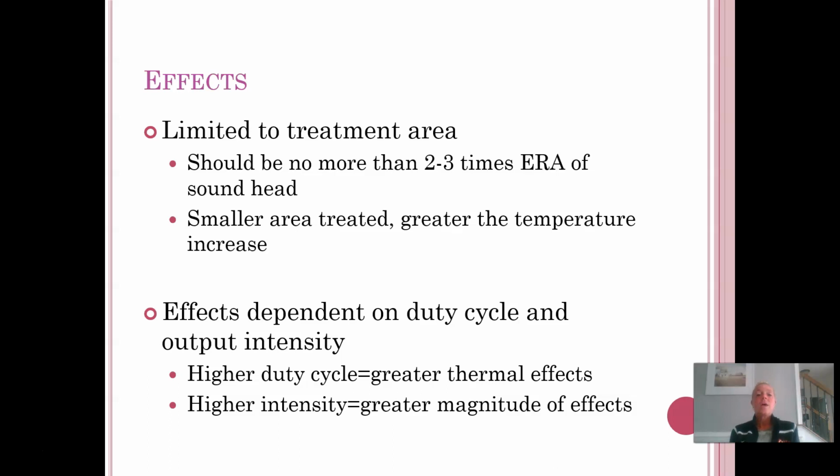Again, the effects are going to be dependent on the duty cycle and the intensity. The higher the duty cycle, the closer to 100%, the more thermal effects. The higher the intensity, the greater the magnitude of those effects. We'll talk about intensities and choosing those, but again, the higher the intensity, the more quickly the person is going to feel those thermal effects.